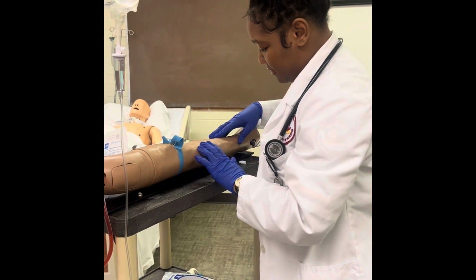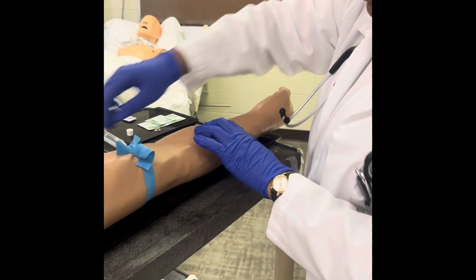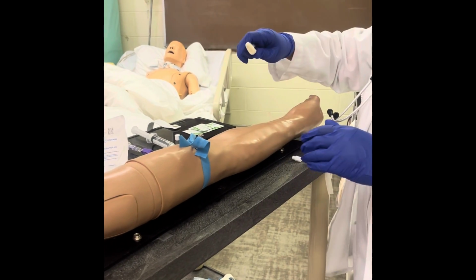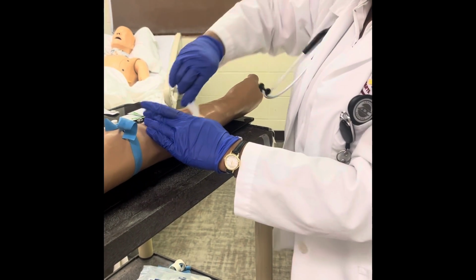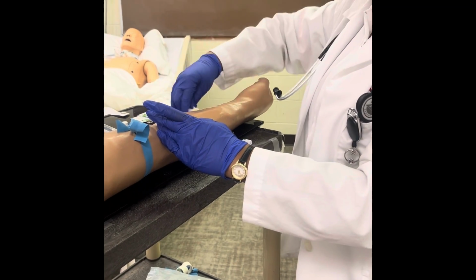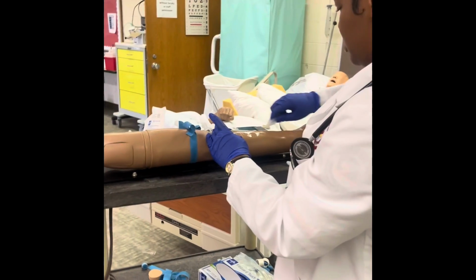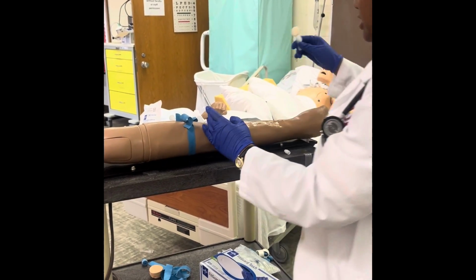Okay, now I'm gonna try to figure out which vein I want to use. Just looks like a good vein. I'll take my antiseptic solution, click it to release the medication, and clean up and down. I'm gonna go ahead and clean the whole arm, just in case I don't get the first stick. Back and forth, and in circles. Now let that dry.